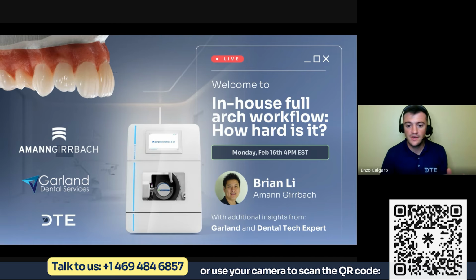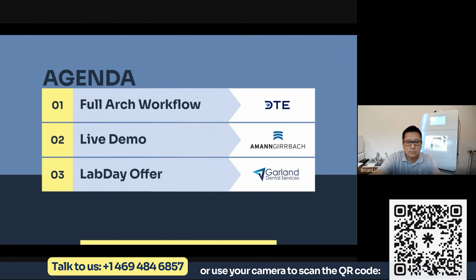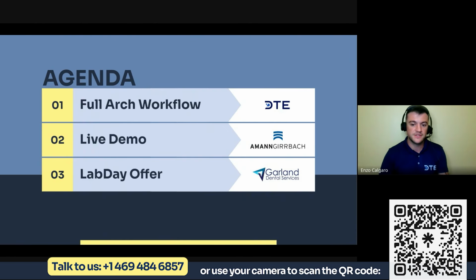Perfect. So the basics that we're going to cover today. First of all, I'm going to be handling the first part of this presentation. I'm going to do the full arch workflow in terms of stages and technologies available. After I finish, Brian is going to take over and show you how this actually looks in day-to-day, in a real lab, in a real clinic. And Rebecca is going to finish it off, talking about the investments and what you actually have to put on the table to be able to have something like that.